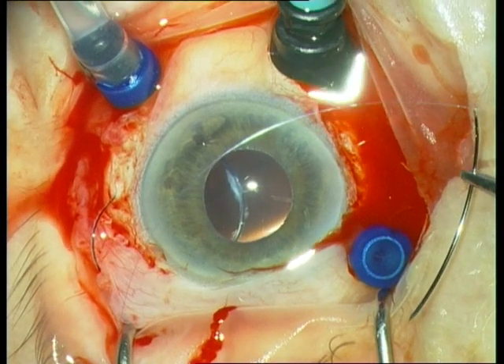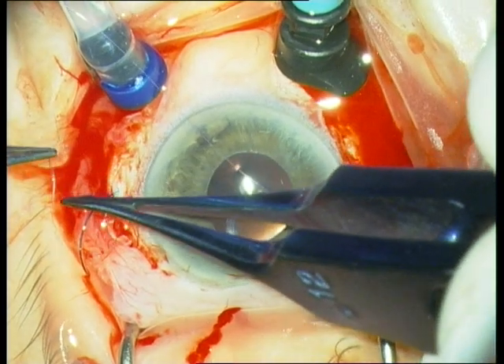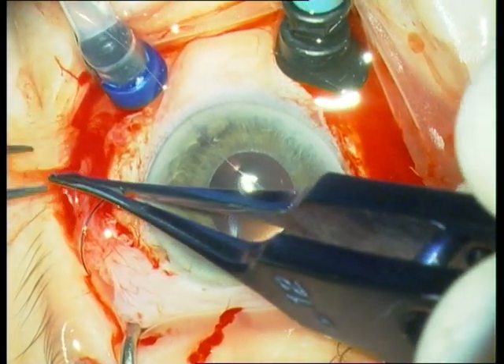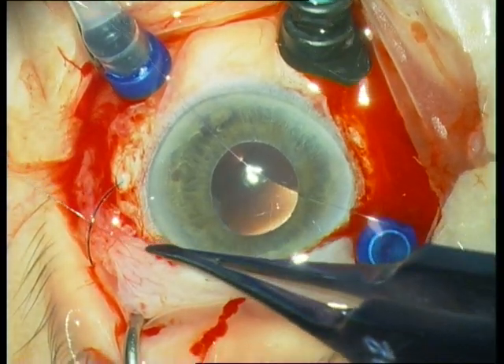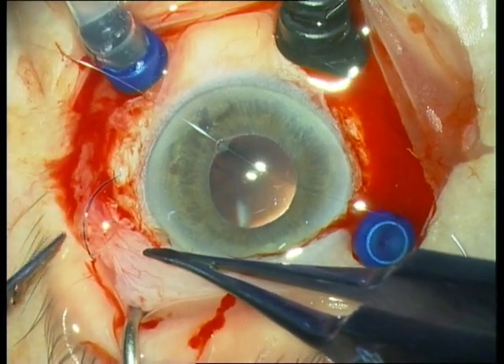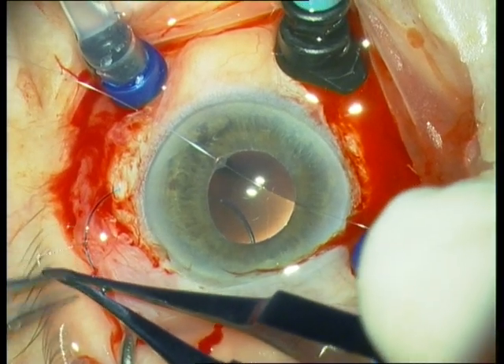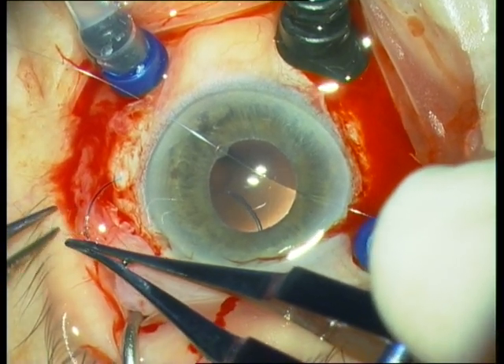Then we take a Prolene 10-0 suture with two bent needles, cut it in two halves from Alcon, and suture one half to the haptic — a quite tedious procedure.